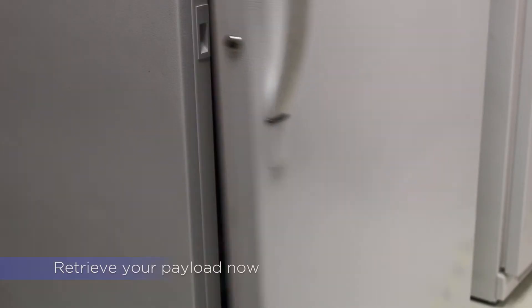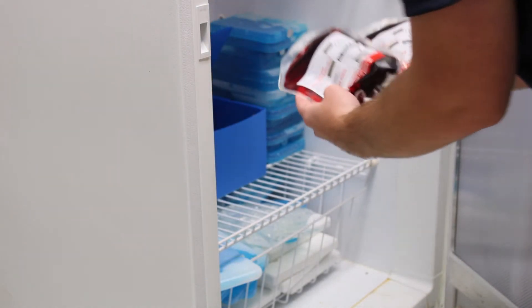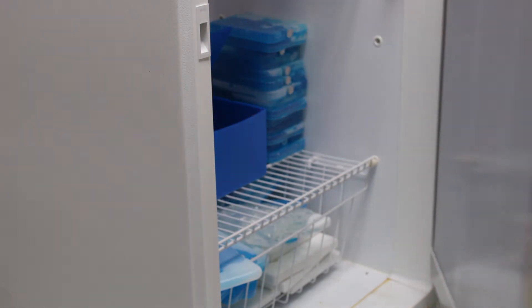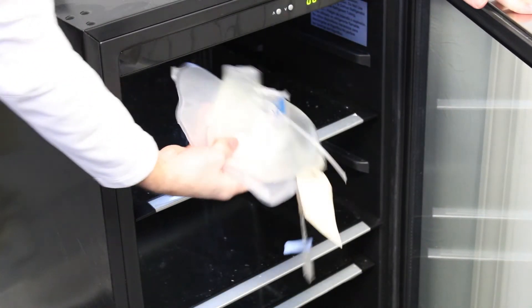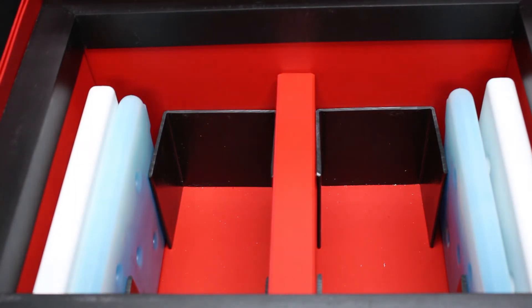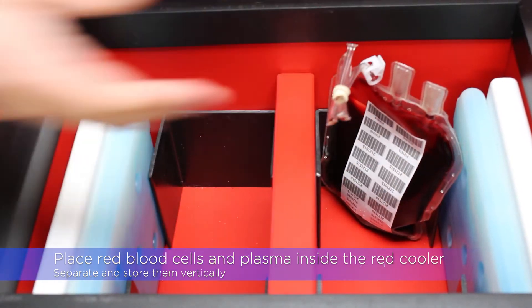Now you will retrieve your payload. The red blood cells and plasma will go into the red cooler. Place them into their container slots vertically.